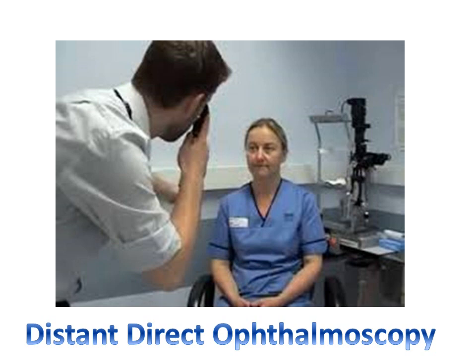This is a picture of distant direct ophthalmoscopy. You can observe that the examiner is holding the ophthalmoscope in the right hand, and he is using his right eye to examine the right eye of the patient. So it's right, right, right for the right eye, left, left, left for the left eye. So at an arm's distance he is examining.